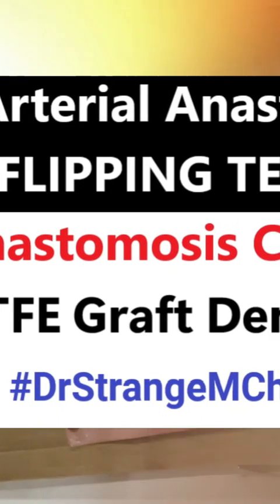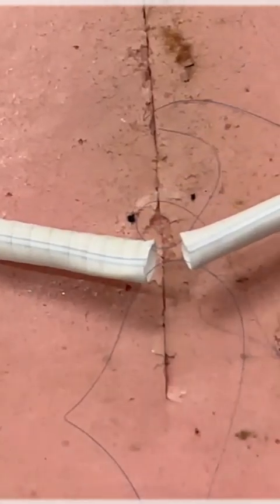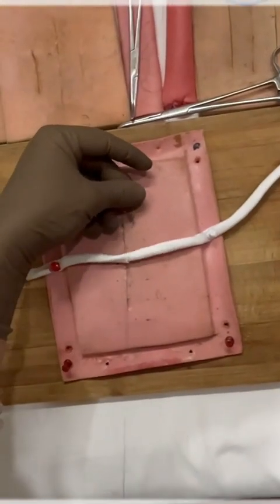The blue line is, as you can assume, marking. So now we are bringing the farther end, that is the 12 o'clock suture, beneath the arterial wall. So it rotates this way, and you can easily see. So the 6 o'clock goes to 12 o'clock, 12 o'clock goes to the 6 o'clock, and the posterior wall of the artery is basically exposed.